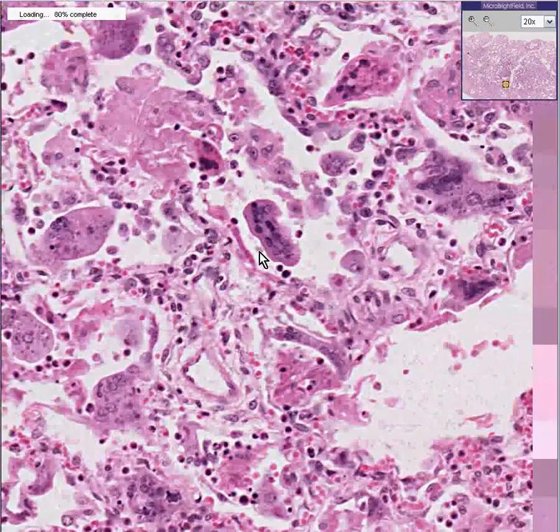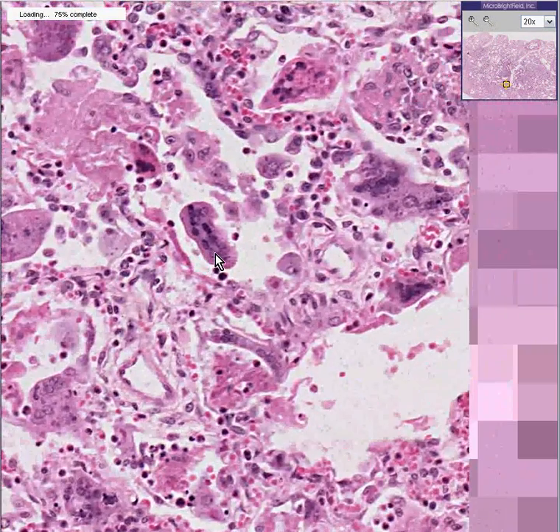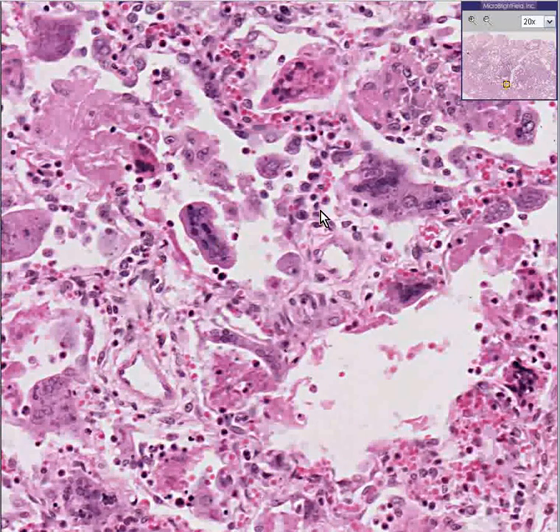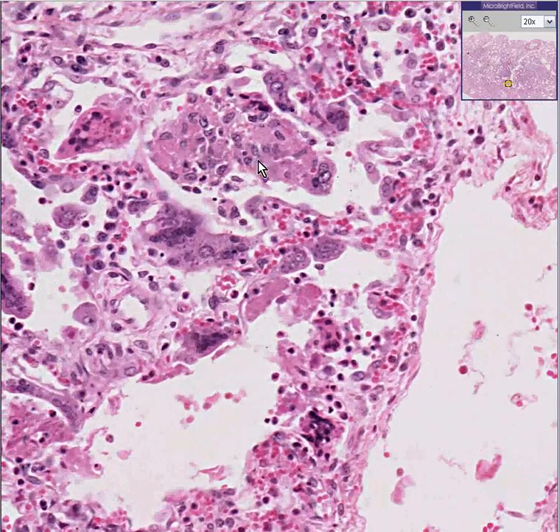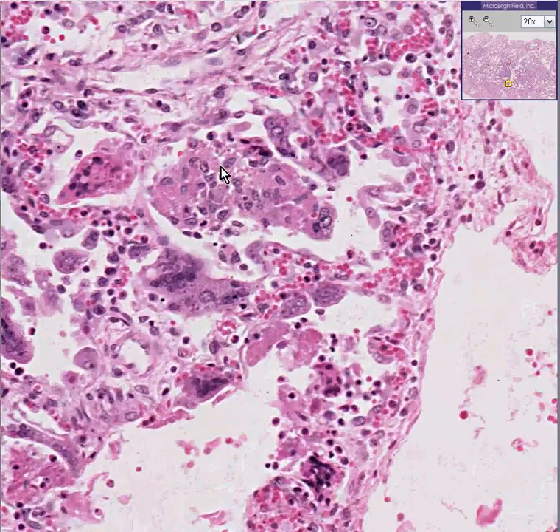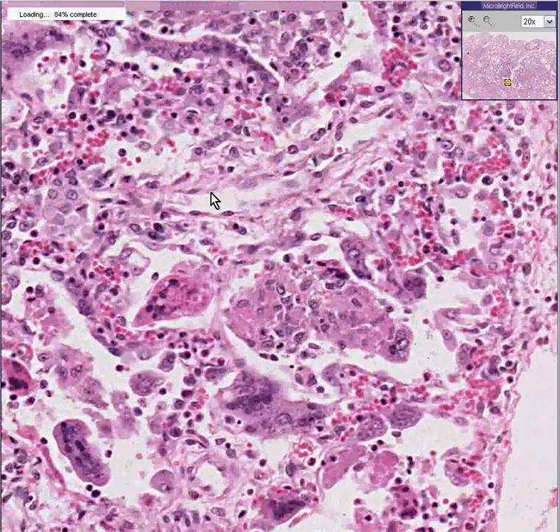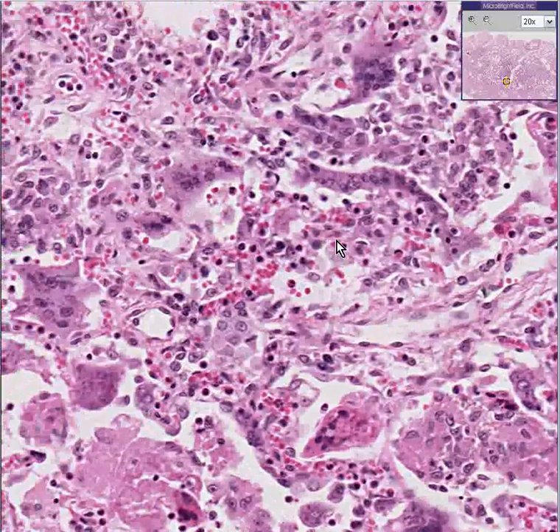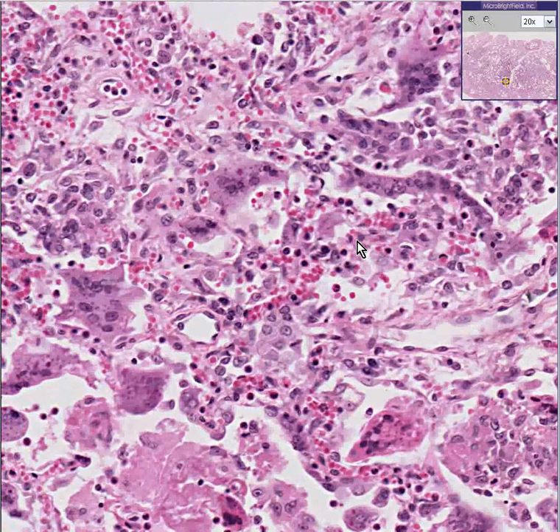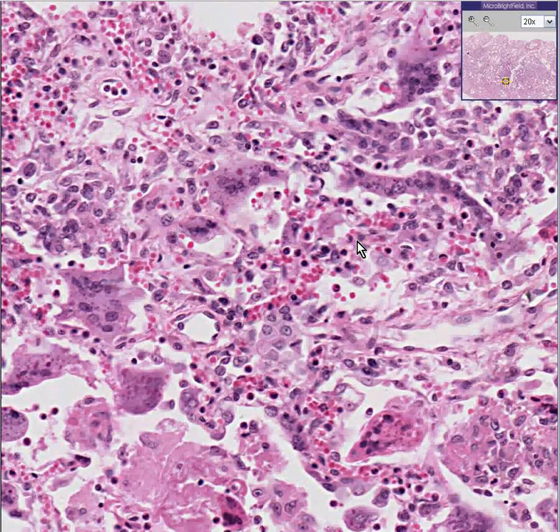So giant cell pneumonias in kids who have not been vaccinated for measles are regarded worldwide overwhelmingly as measles until proven otherwise. Thank you very much.